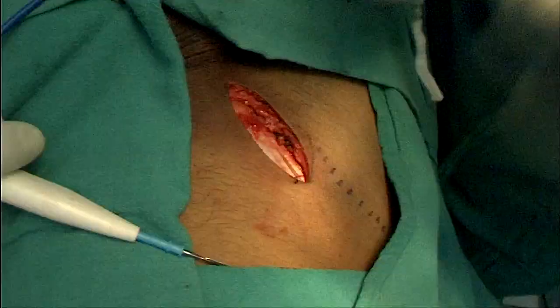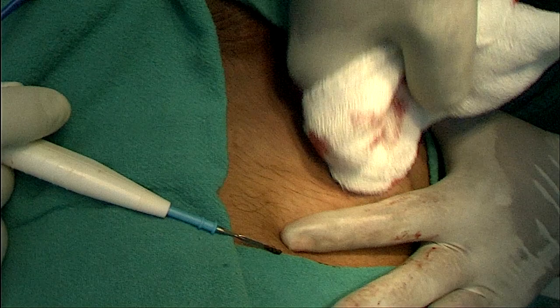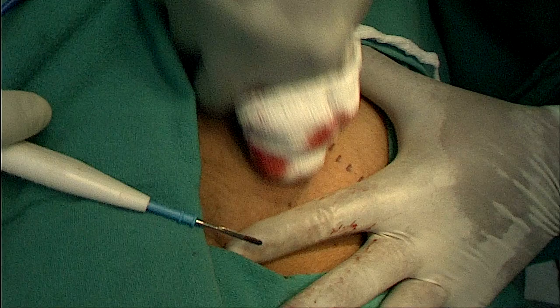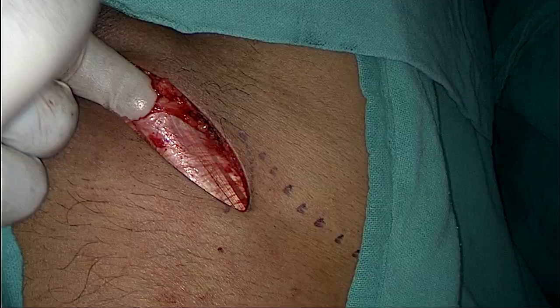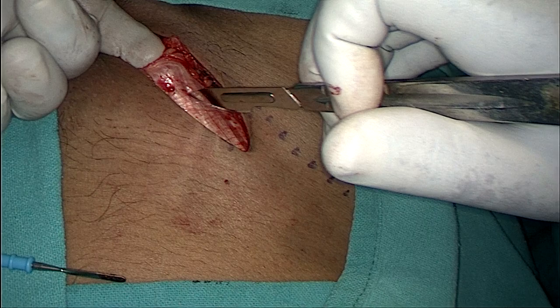Just separating the tissues from the external oblique aponeurosis. Now you can appreciate the fibers of the external oblique aponeurosis running in the same direction. I'm holding the superficial ring with my left index finger and cutting down the external oblique aponeurosis to gain access into the cord and the sac.